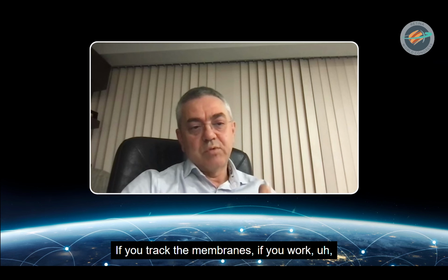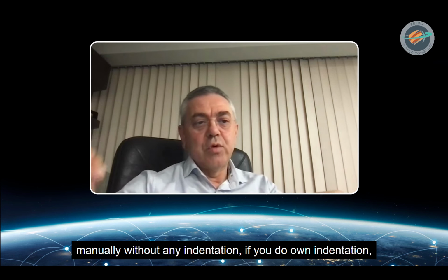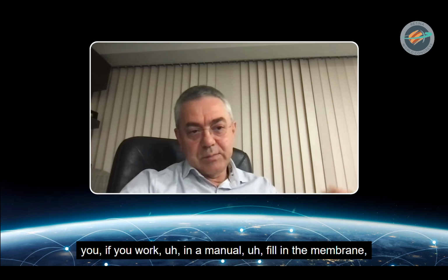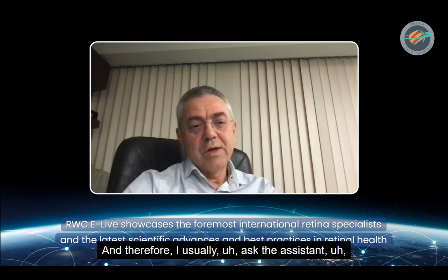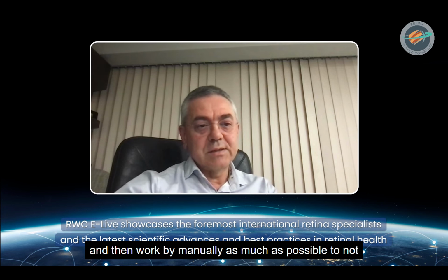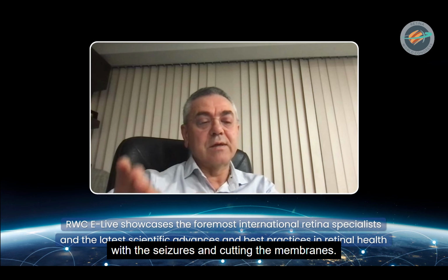If you work unimanually, peeling the membrane without any indentation, you can traction the ciliary body and you can create ciliary body detachments. And therefore, I usually ask for indentation from the assistant and then work bimanually as much as possible, to not traction the ciliary body, to peel bimanually with the scissors and cut the membranes.